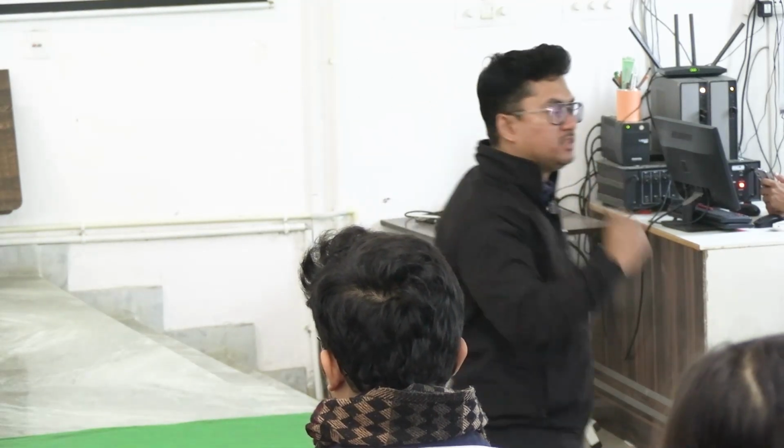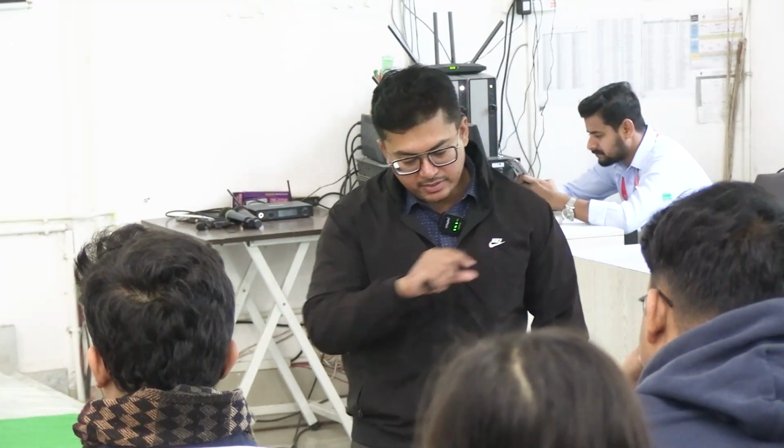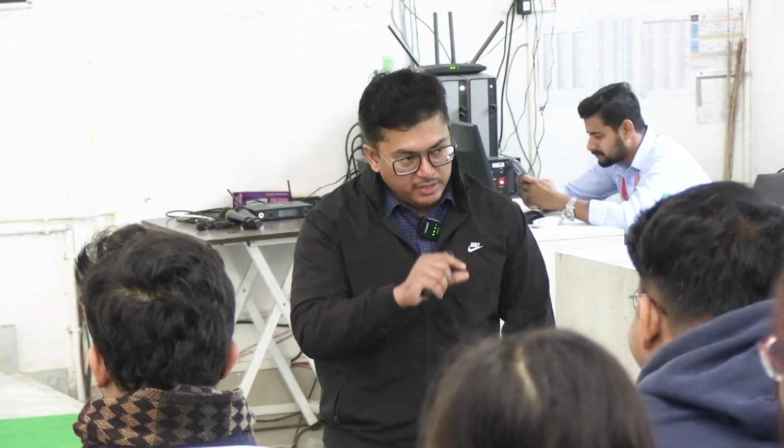Date of collection, date of expiry, yes, what anticoagulant is written. Another important thing is written, I don't know whether you noticed. You see that it is written hepatitis B surface antigen negative, anti-HCV antibody negative, HIV antibody negative, malaria negative.